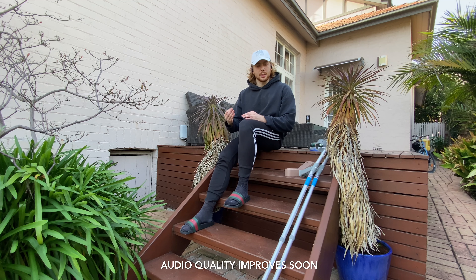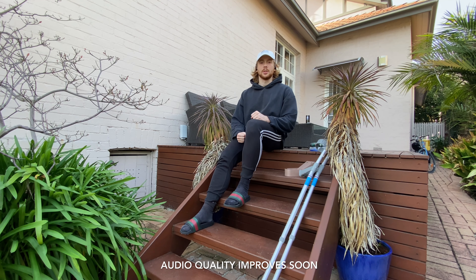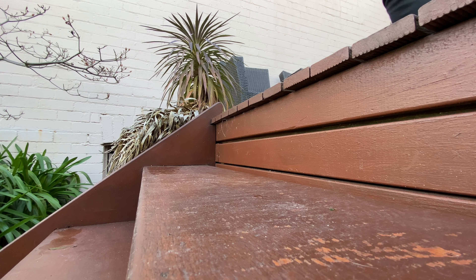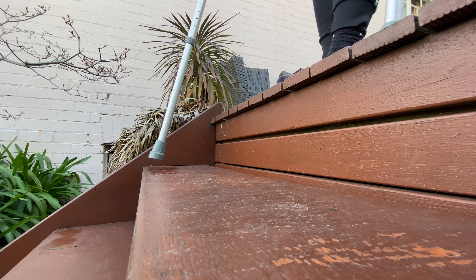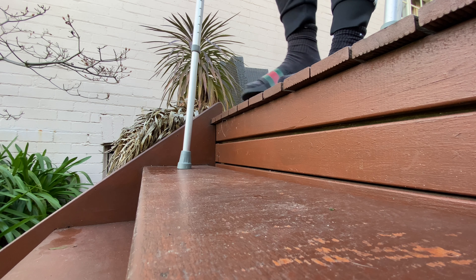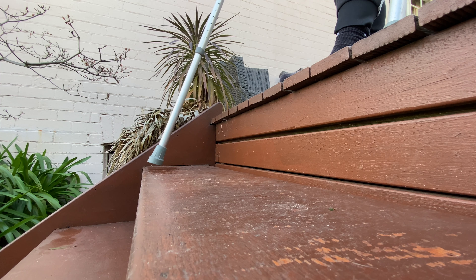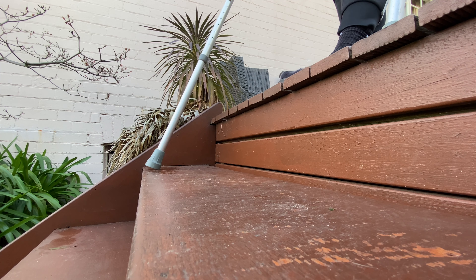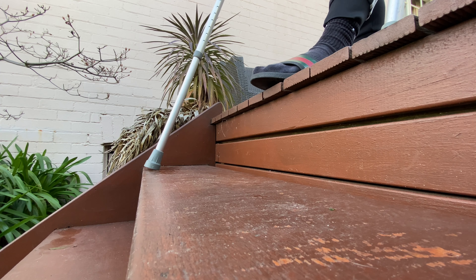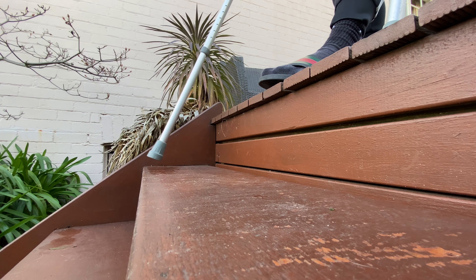When he descends on staircases there is a lack of confidence that when he puts his weight down on the crutches they will support and not slip out from underneath him. As he approaches the staircase he needs to put the first crutch down to support his weight and take it off his legs to move on to the next step. But to do this he can come in at an angle, positioning the crutch more at the edge of the step at a slight angle outwards, and when combined with the risk of water in the outdoor situation, this can lead to slipping off the front.